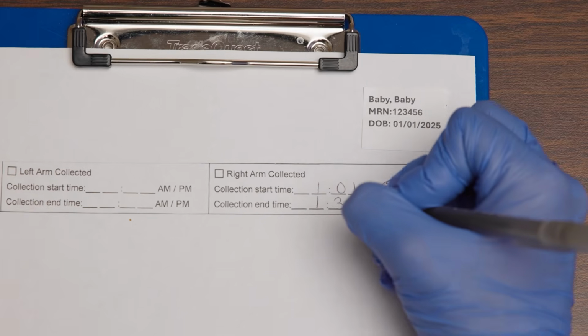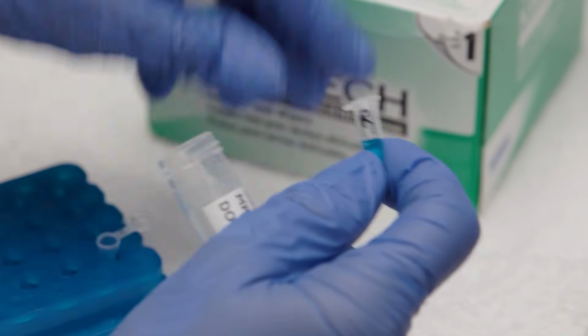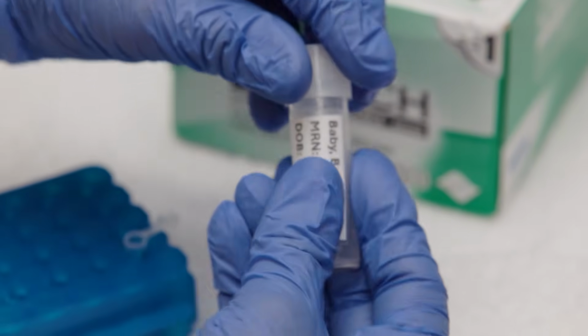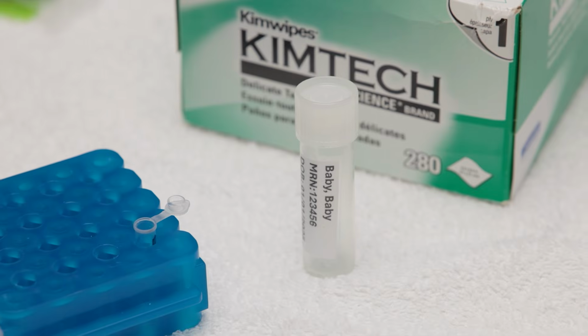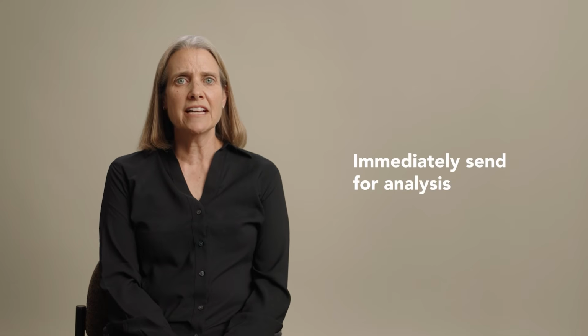Document the time the collection is complete. Place the microtube into a carrier tube. The specimen should be labeled with 2 patient identifiers and an indication of the collection site, either left side or right side. Immediately send for analysis following your institute's guidelines.